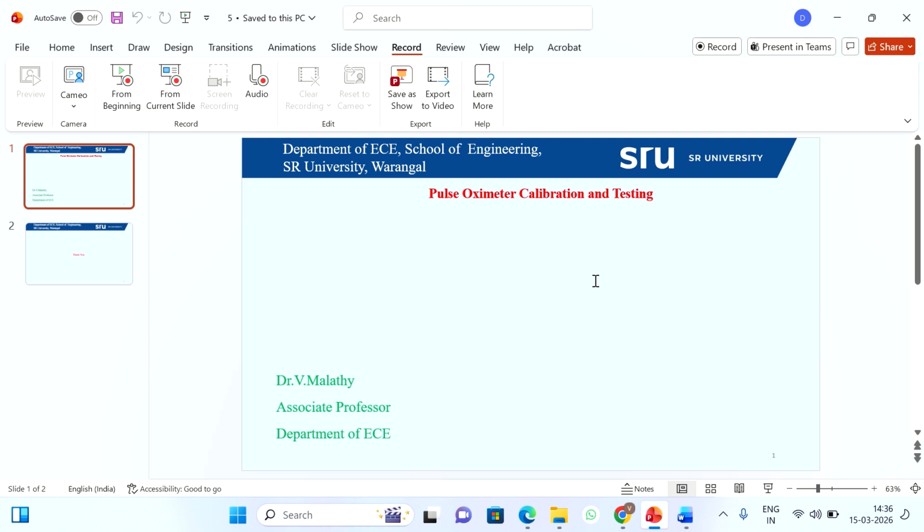Today's video lecture is on simulation of pulse oximeter calibration and testing. In this simulation, we will get a red PPG signal with noise. PPG means photoplethysmography. Then an infrared PPG signal, which is noisy. Both are graphs of time versus voltage amplitude. Then we will measure in the output the red AC component, red DC component, infrared AC component, infrared DC component, and finally the ratio R, which is equal to red AC by red DC, divided by infrared AC by infrared DC.